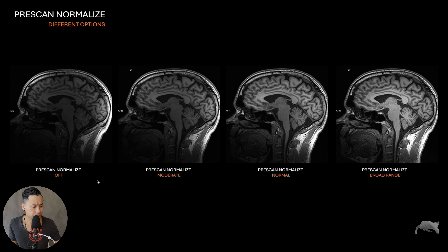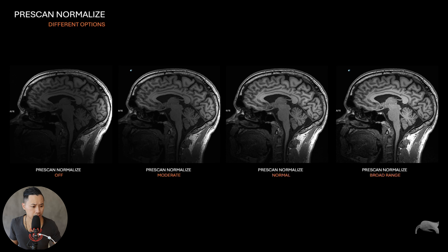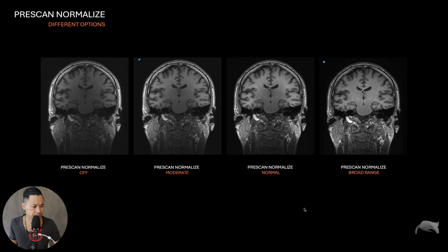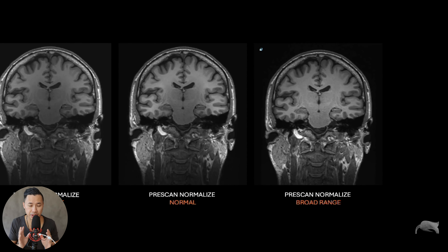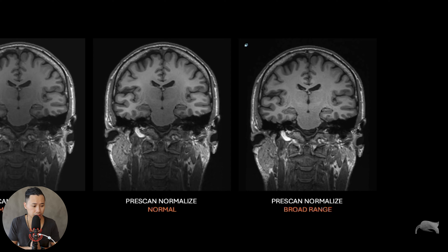I did one more test on the brain — this is a 32-channel brain coil on 3T. We compared off versus broad range. Looking at it with off, it's quite bad because the signal is very bright in the upper part of the brain and the lower part gets darker and darker. Usually we use the normalize option which is the standard, but looking at the reconstructions using broad range, you can see that the middle part of the brain is much more homogeneous compared to the normal setting, where you get a little signal loss or inhomogeneity and things get darker.